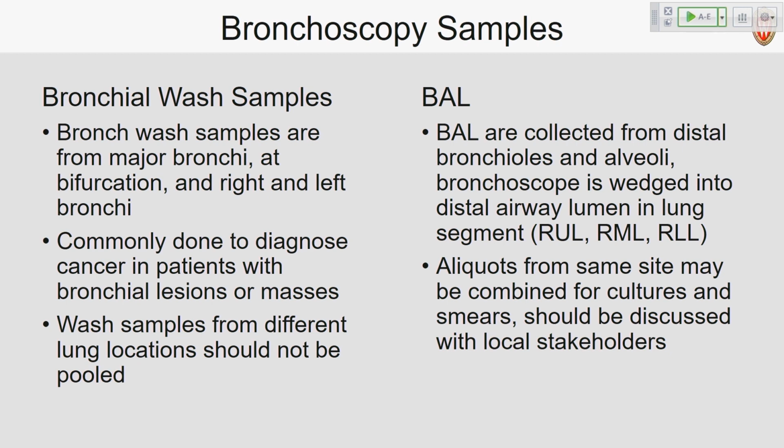So this would be routine bacterial cultures. It is also worth having a conversation with ID and pulmonary to get their input on fungal and AFB as well. I've heard some different things in conversation with them, and some of it just comes down to provider preference, or even provider understanding of what you're really asking to be able to do with the specimens when they're down in the lab.